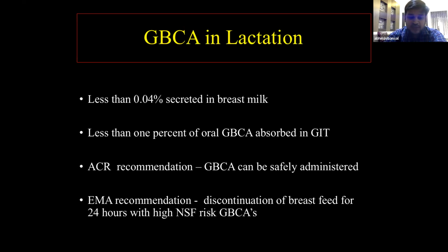Whereas the European Medicines Agency recommends discontinuation of breastfeeding for 24 hours with high NSF risk GBCAs. The basic practice usually followed is that it should be discussed with the patient and the clinician, and the breast milk can be expressed by the mother before the examination. That can subsequently be used during the 24 hours after introduction of the contrast agent. During that period, it is better to just express the breast milk out, and after 24 hours, normal feeding can be resumed.